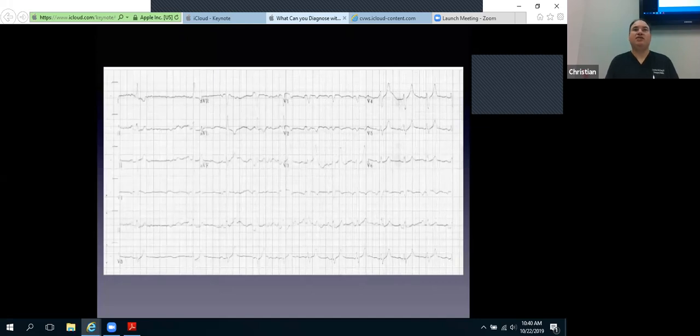Blood was drawn, and an ISTAT was resulted after declaring the patient, and it came back as 7 point something. Well, that's not helpful, right? It's helpful if you keep going with CPR and then get your ISTAT result.